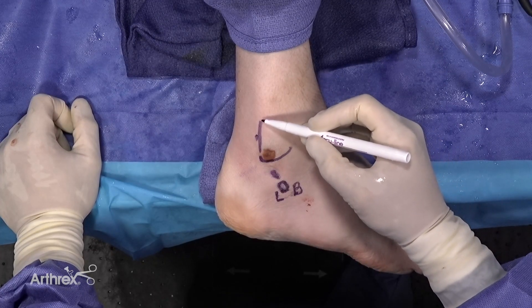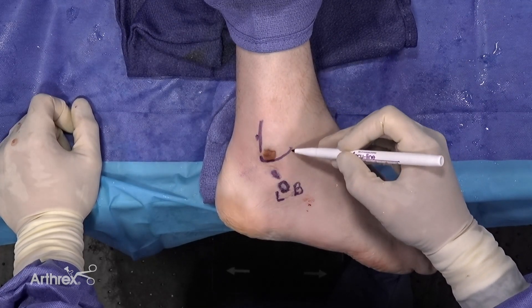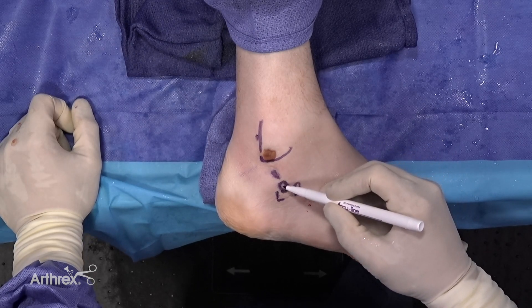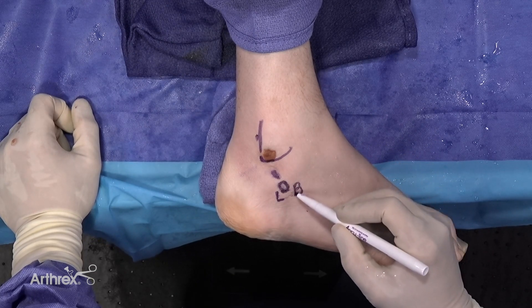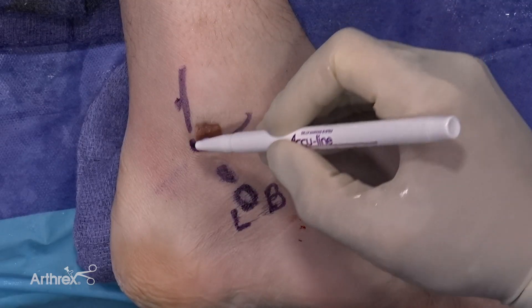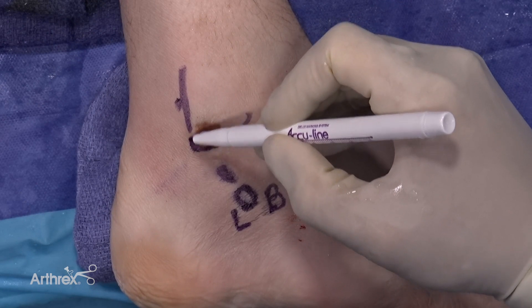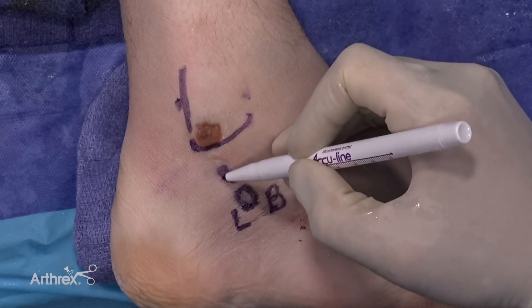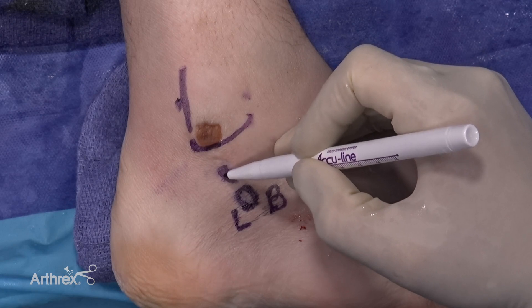This is the skin landmark fibula as outlined here. This is the peroneal tubercle. This is an outline that allows us to identify peroneus brevis in the front and peroneus longus in the back. Usually the portal is about 2 cm approximately proximal to the tip of the lateral malleolus as a proximal portal, and 2 cm distal to the tip of the lateral malleolus as a distal portal.